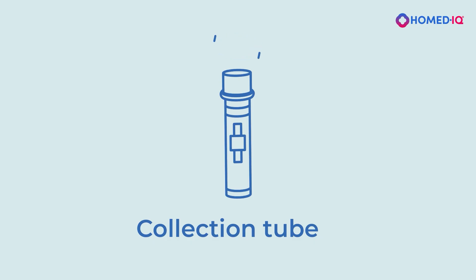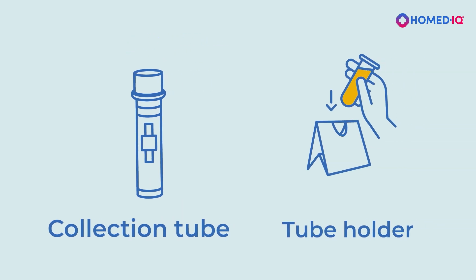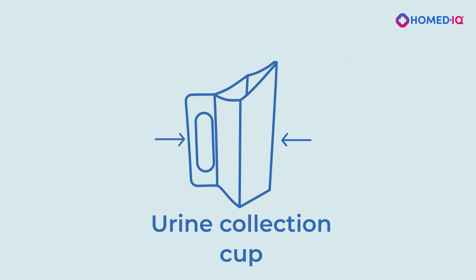Twist to remove the cap from the collection tube and place the collection tube in the provided tube holder. Make sure that no liquid spills out of the collection tube. Open the urine collection cup by squeezing the opposite corners. The cup has a plastic liner — take care not to tear or puncture the liner.